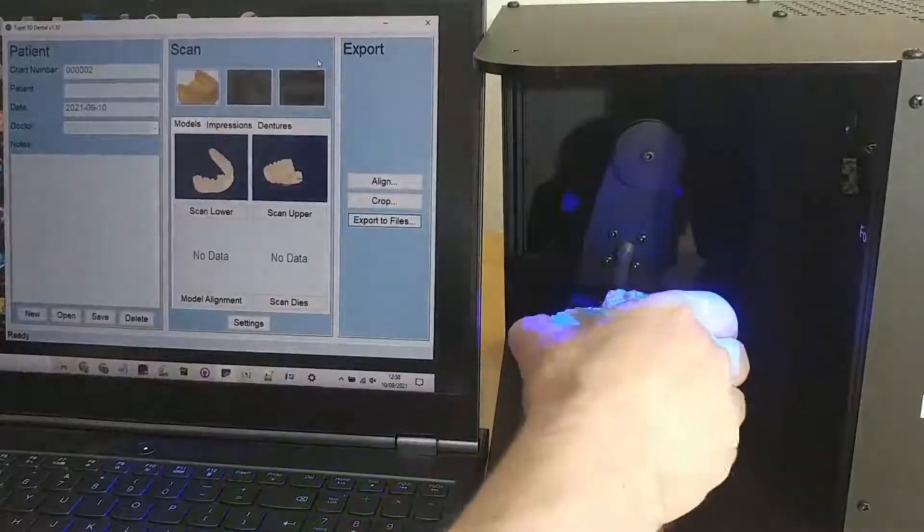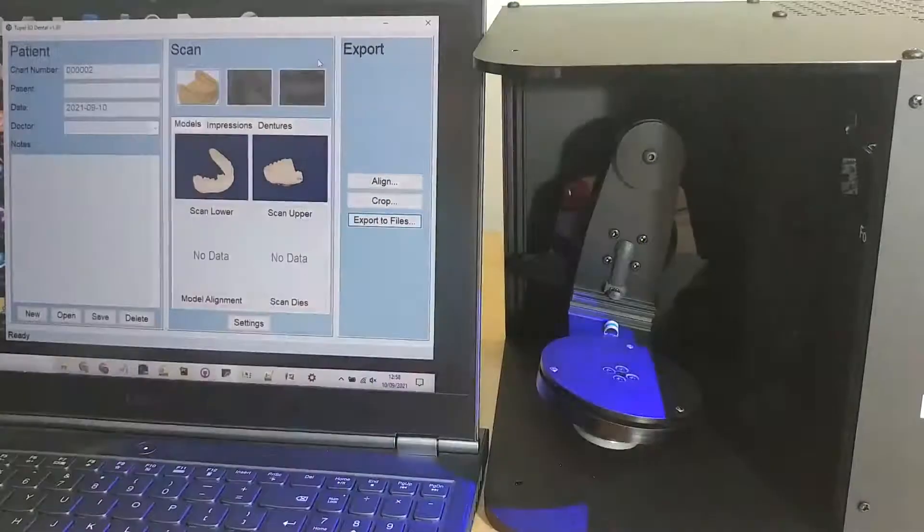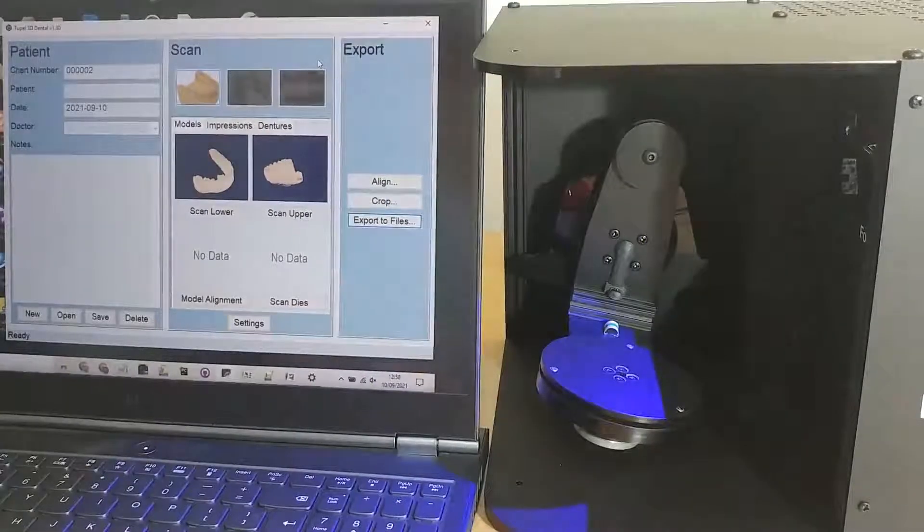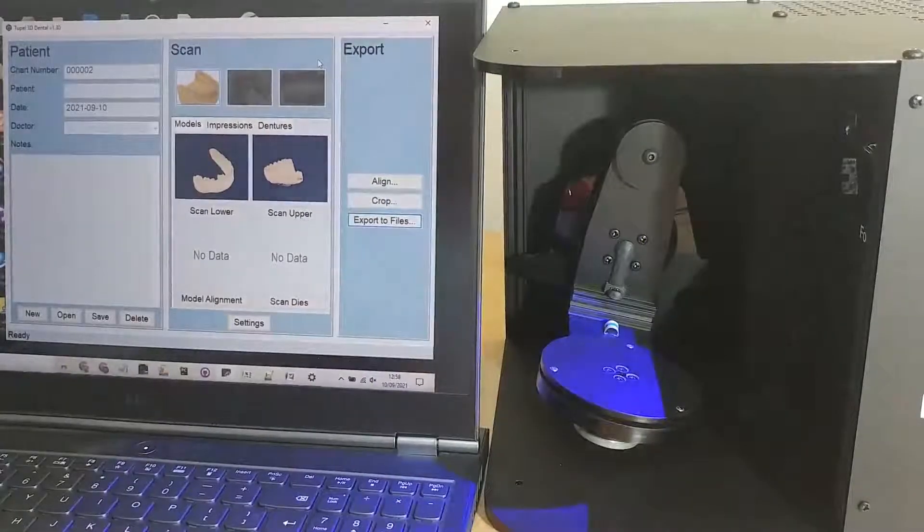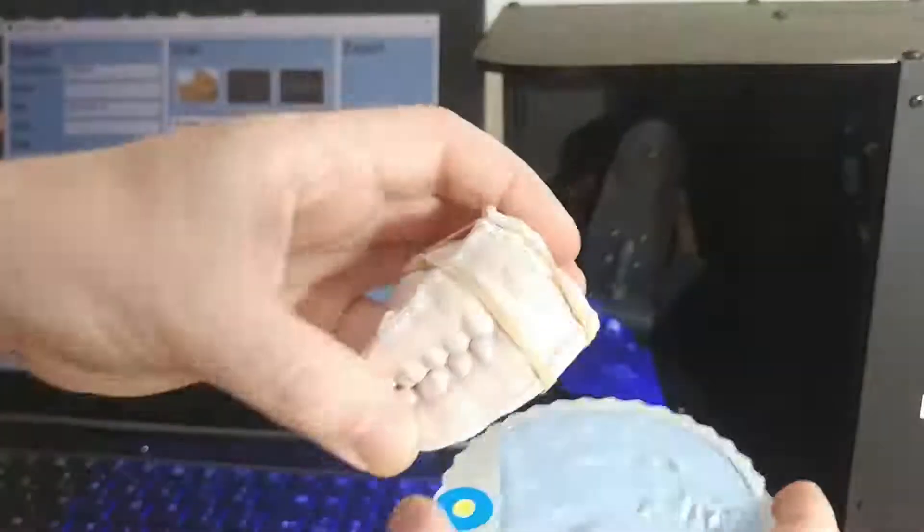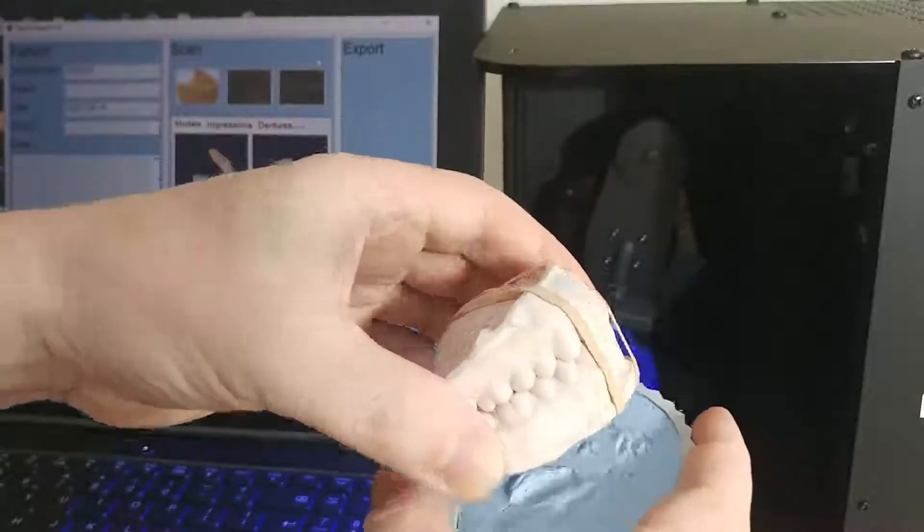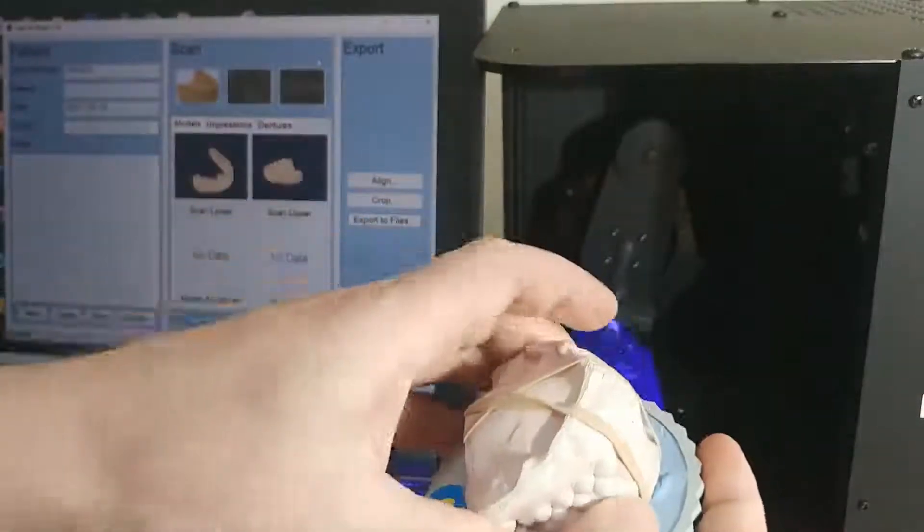I'm rubber banding the upper and the lower models together so they fit in the position with each other. And now I can make an alignment scan.